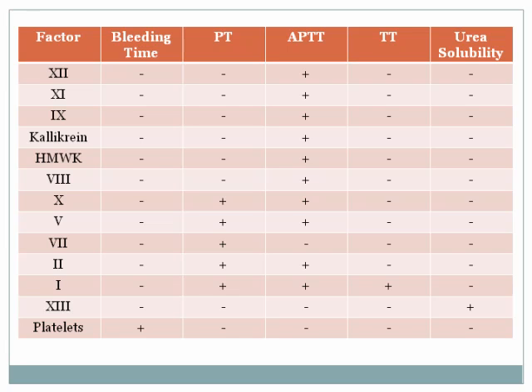The bleeding time test is a really old-fashioned test. Basically, you put the blood pressure cuff on and set it to 40, then make a small incision on their forearm, and you sit there and see how long it takes them to stop bleeding. This one is only assessing platelets and platelet function. Because it's a very minor small cut, it's only the platelets that really are getting tested on this and how they're functioning.